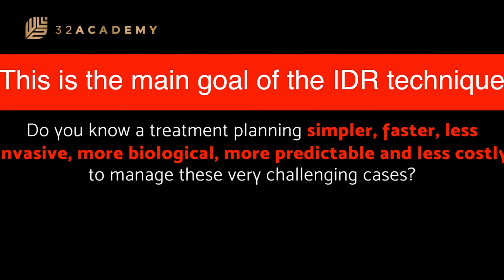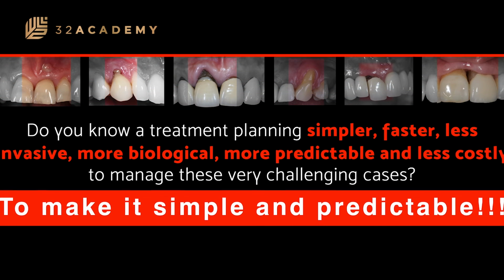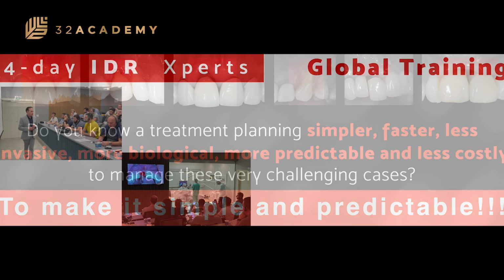This is the main goal of the IDR technique, to make it simple and predictable using this concept in one single procedure, one single surgery, without opening the flap.